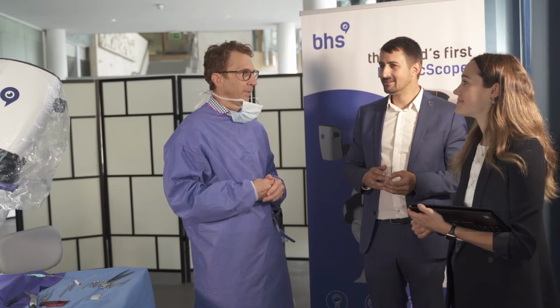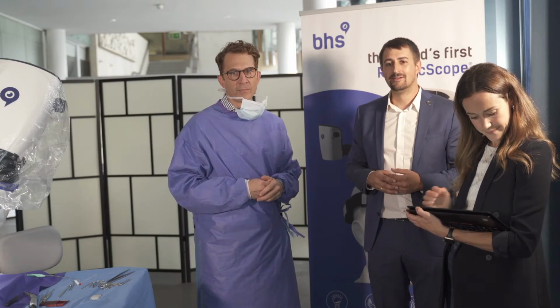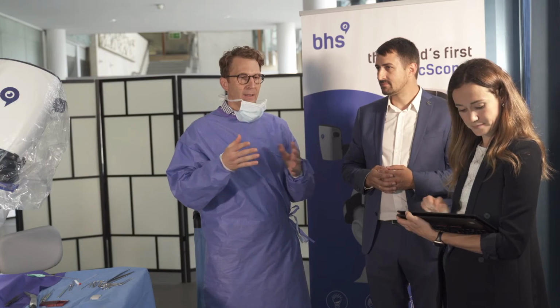So it looks like the brain is more flexible with that than we ever thought. Yeah, I think what counts is the picture, and not the angle by which the picture is created. We are used to doing surgical procedures with angled scopes from FESS surgery, the paranasal sinus system, and I think this is something you get used to.